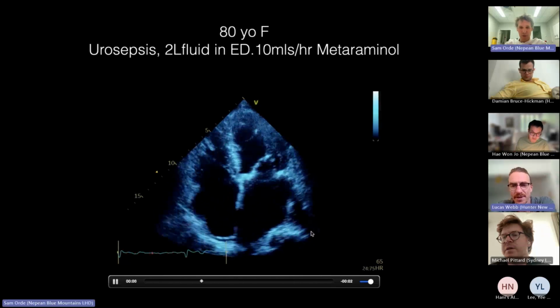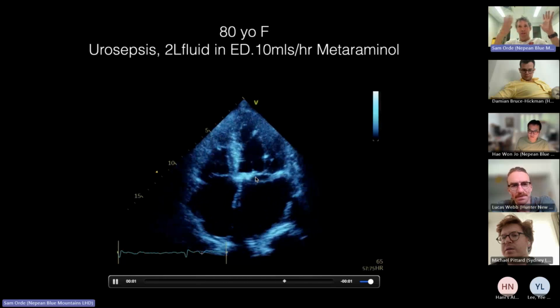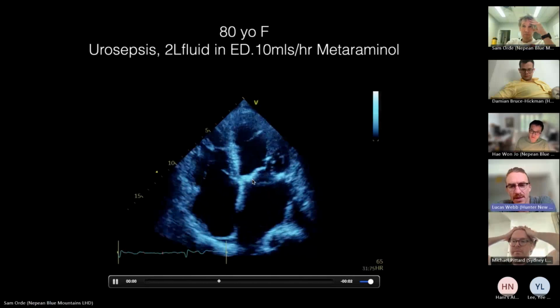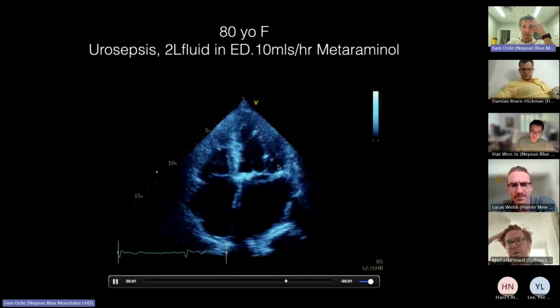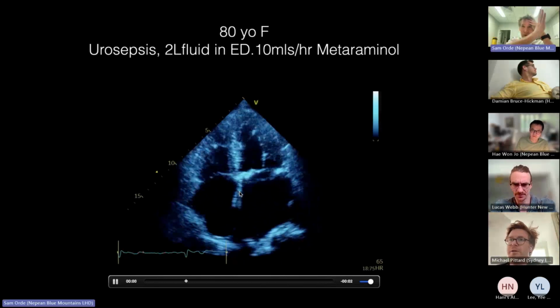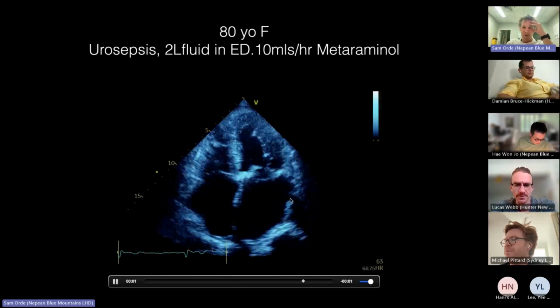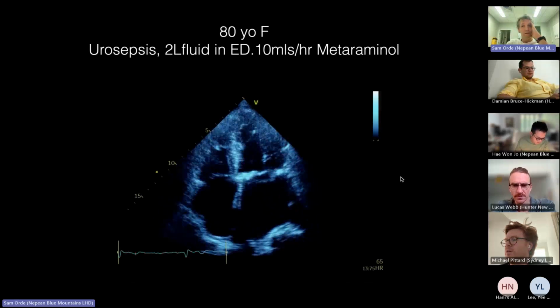Yeah, and nice shadows. What do we call that? Because the opening of the valve, you see, it's almost shadow in the middle rather than at the sides. So that's acoustic shadowing, is it? Yeah, nice. Acoustic shadowing from mitral annulus and mitral annular calcification. Excellent. And all of that stuff mixed in with that, and you can see the interatrial septum pushed over to the right. Again, as you said, that left atrial size, that mitral annular calcification, the interatrial septum, all could be pointing towards raised left atrial pressure. Nice.